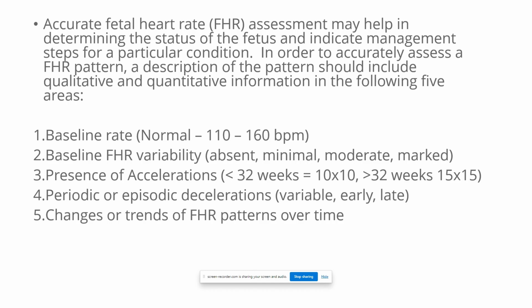Okay, so when we are reading a strip, there's a couple things that we need to keep in mind. An accurate fetal heart rate assessment may help in determining the status of the fetus and indicate management steps for a particular condition. In order to accurately assess a fetal heart rate pattern, a description of the pattern should include qualitative and quantitative information in the following 5 areas.